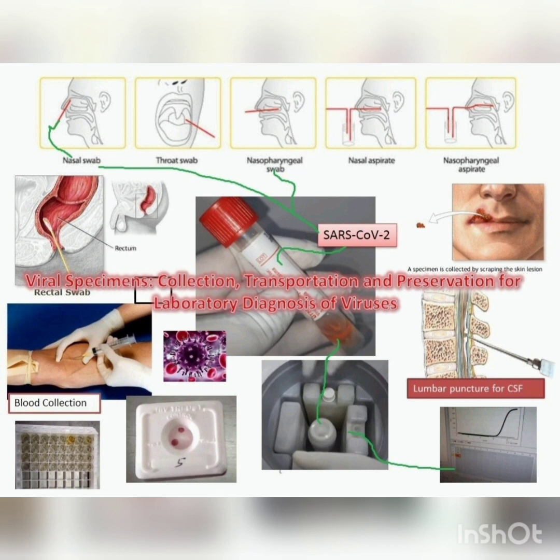Transport media should be used only when there is a delay. Transport media can safeguard the material for a long period of time, so it needs to be used only if there is any delay in transferring the specimen to the laboratory. These are some of the points to be kept in mind while collecting a sample from the patient.